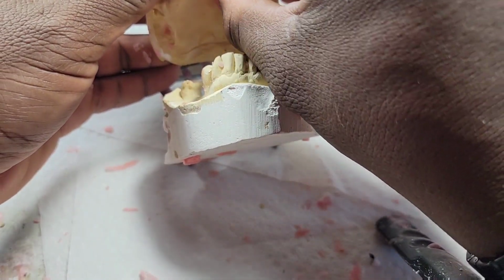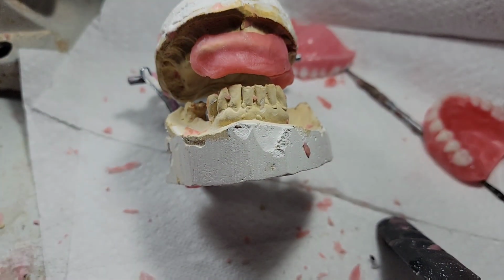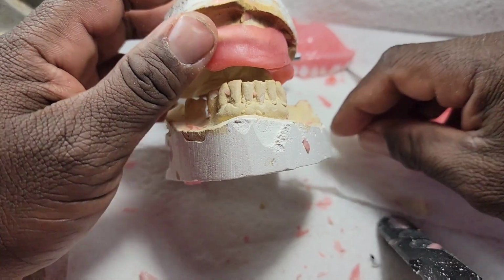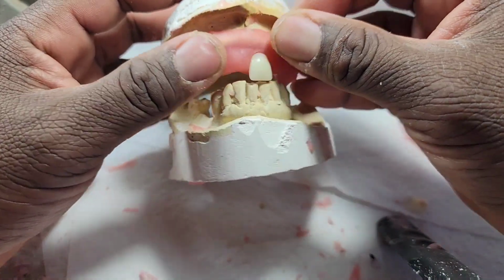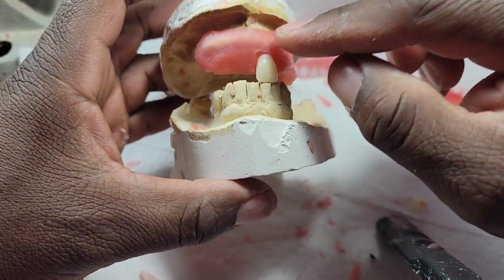So here it is. I'm gonna do that demonstration, try to put some teeth on this to show you. I'm just picking any teeth. I'm going to get this right here. You see that distance?